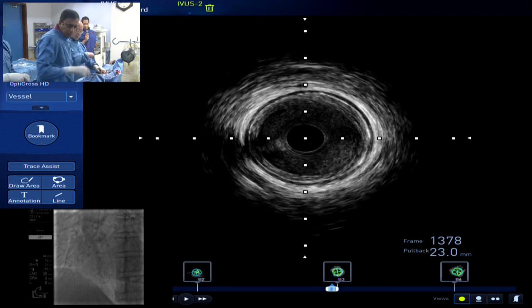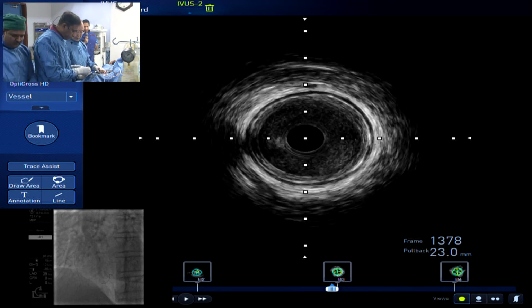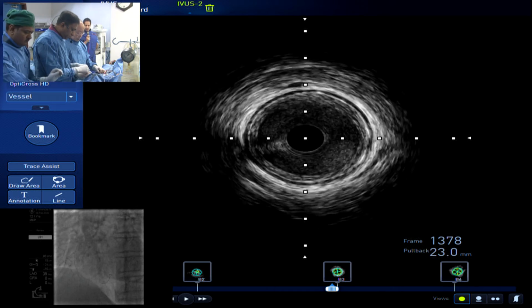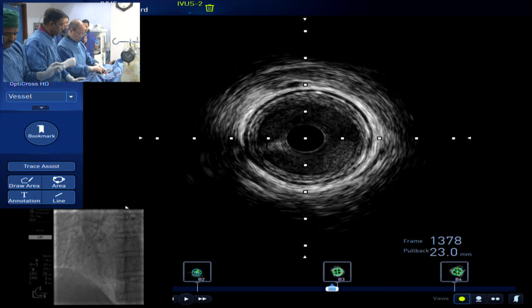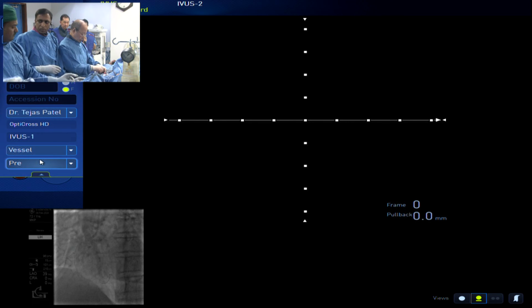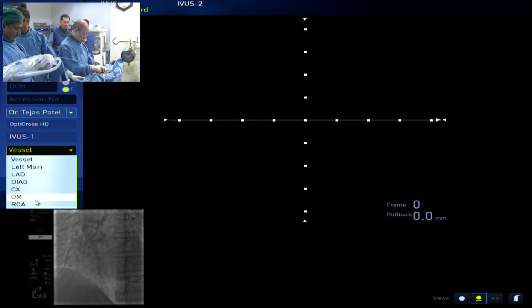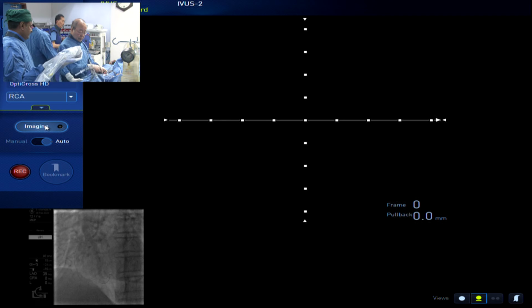It's just that low frequency event of a serious complication that concerns us. And we know from Aaron Grantham's registry data, and he'll, I hope, share some stuff with us, that the major adverse event rate is not insignificant. For that reason, I feel that maybe for now we should be monitoring patients a little closer. Tak, any comments on that?